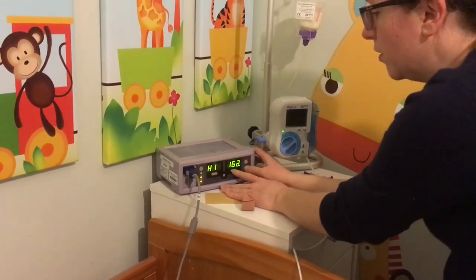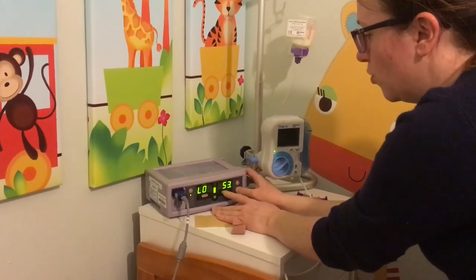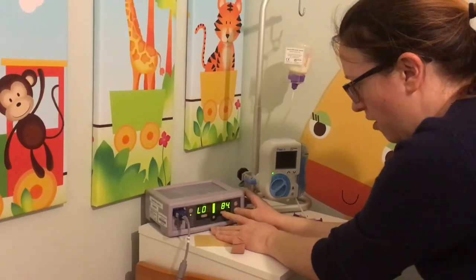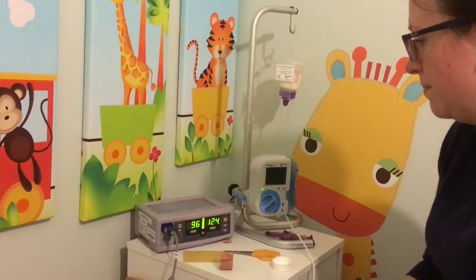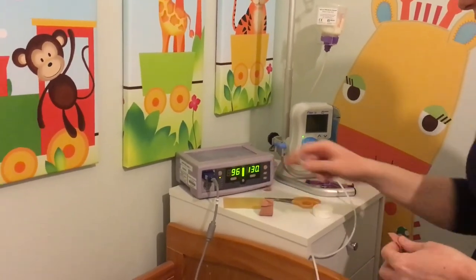So we just have to put the limits up — I have to do this every time we turn it on because it's forgotten them from yesterday. We put the high on to 185 for his heart rate and then low on to about 85 for his heart rate. Then his oxygen is on low of 90, high of 100%. So as you can see, it's working — his oxygen level is currently 96 and his heart rate is 130.